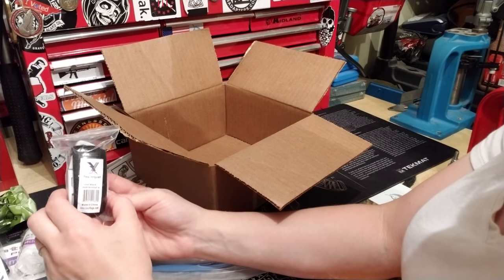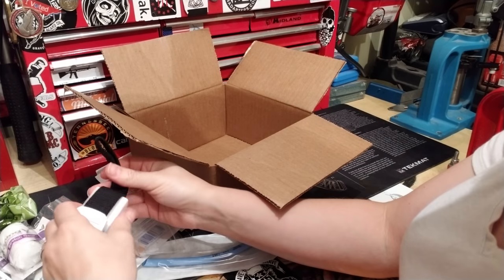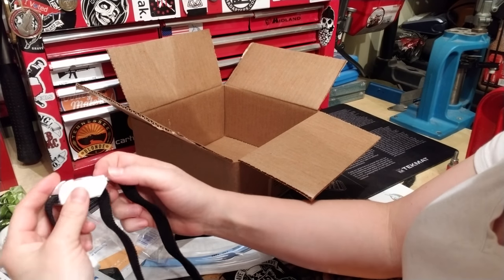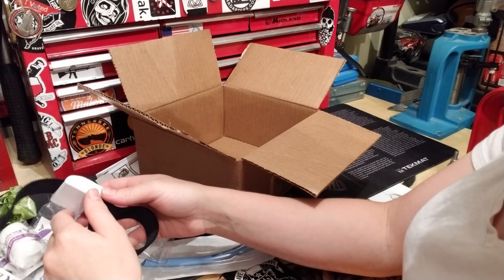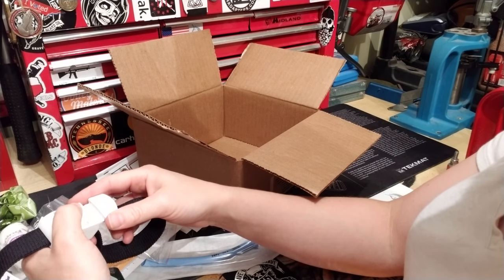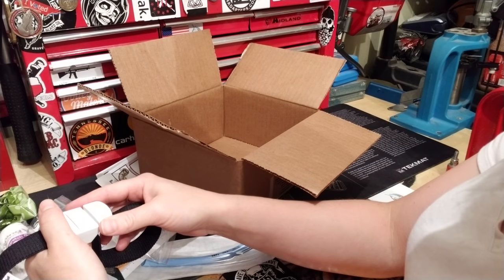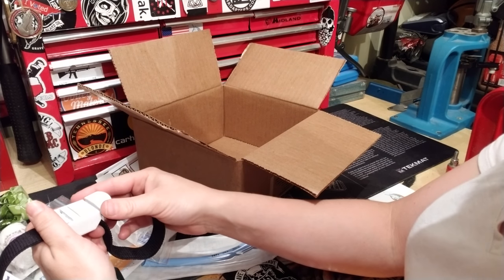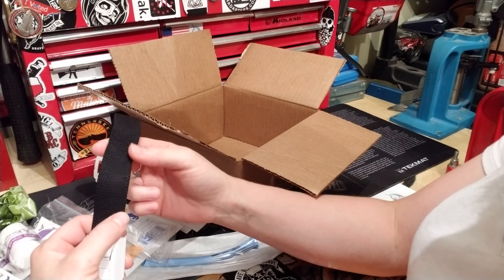There's a regular tourniquet made of industrial material — kind of like a belt. You wrap it around the arm and pull. These are nice because with blood on your gloves, rubber tourniquets get slippery and hard to tie. This style just loops and pulls. Don't go any thinner than this width.